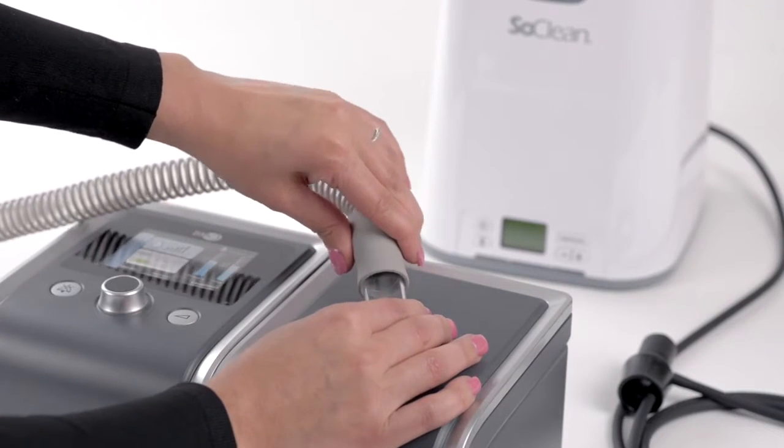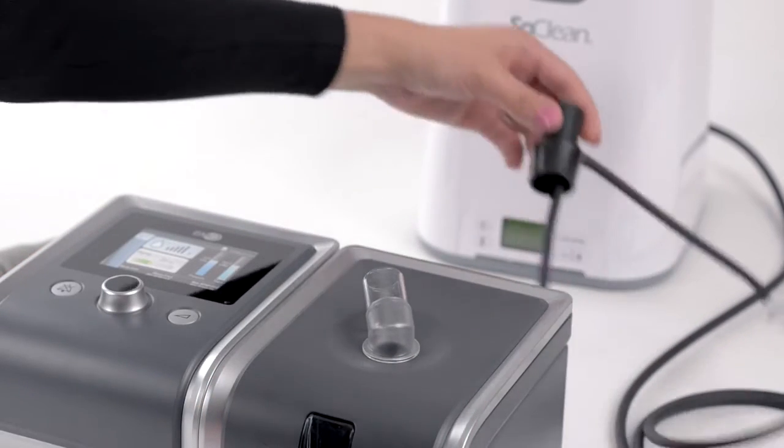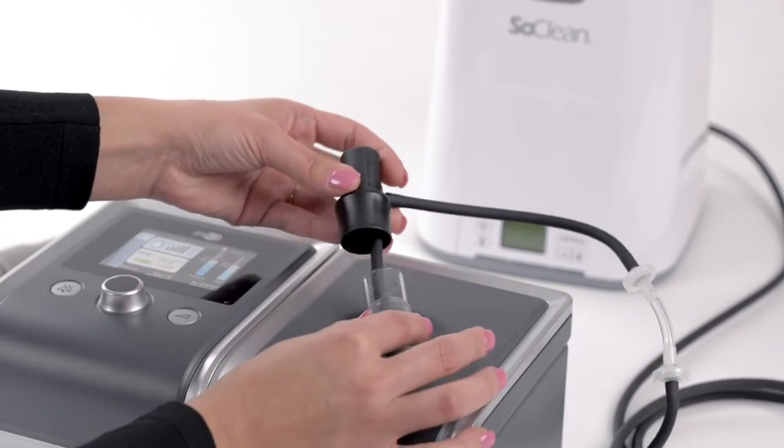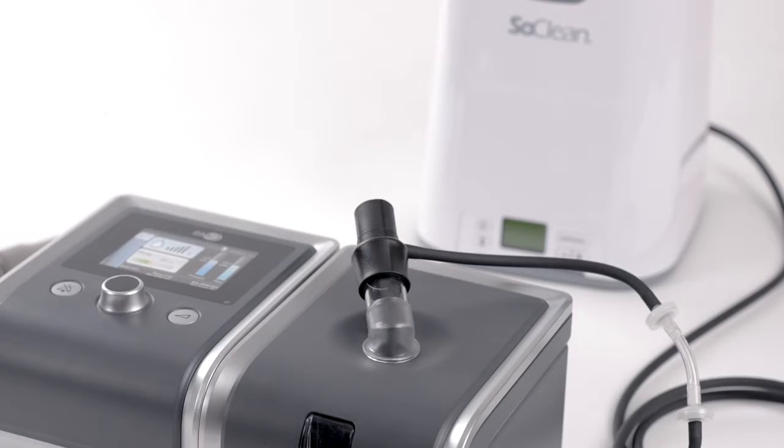Disconnect your CPAP hose from your CPAP machine. Position the injection fitting onto the port of your humidifier, allowing the smaller tubing to enter into the reservoir. The end of the tubing should rest on or near the bottom of the reservoir, over the heat plate.